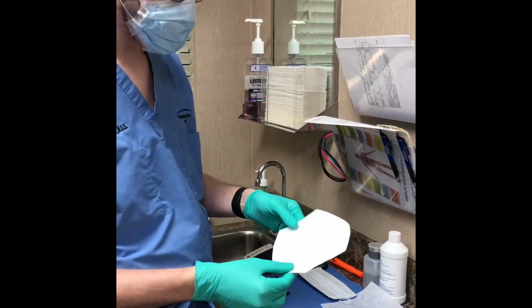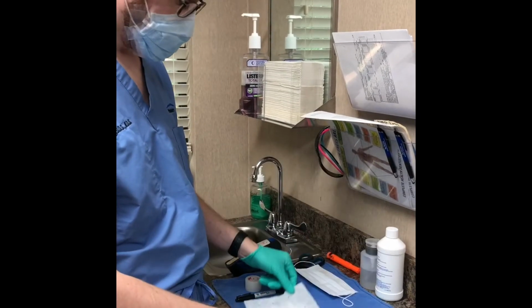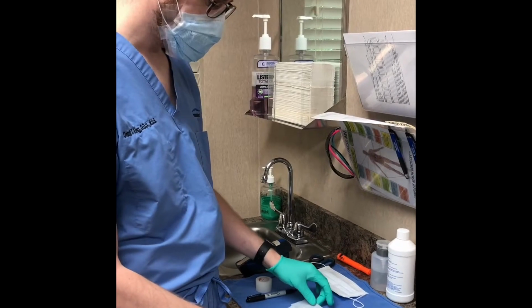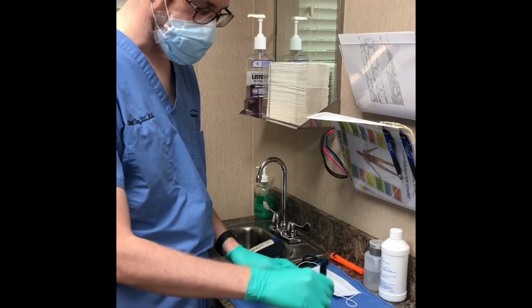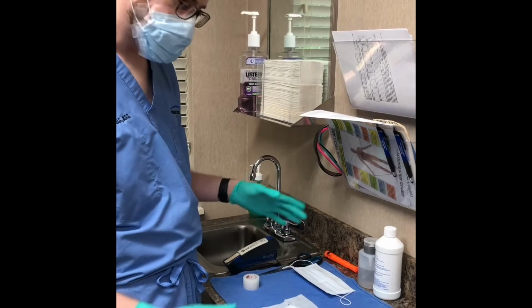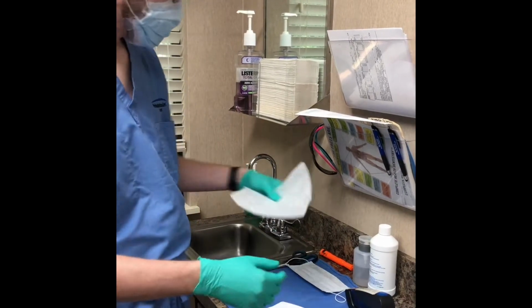I've got one on right now. But with the template, what you'll do is lay a square of the material over it. You can see through it pretty well. It's thin enough to where you basically just use it as a stencil. And so with a marker, I put dots around it, and that way that gives me something to cut out. And then we'll go through and we will cut it out.